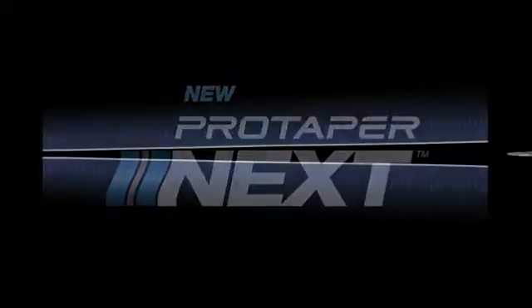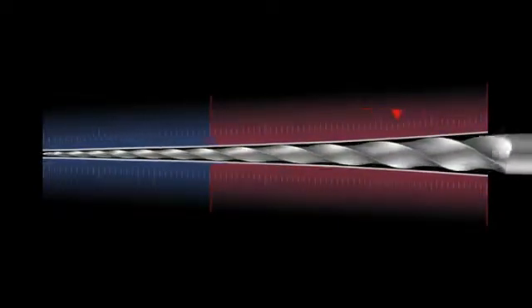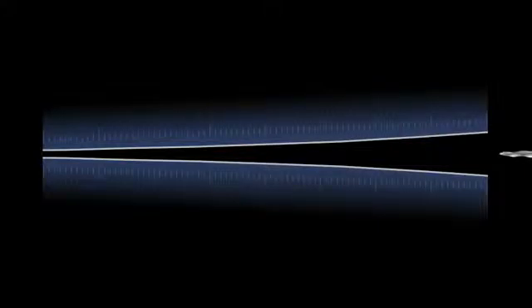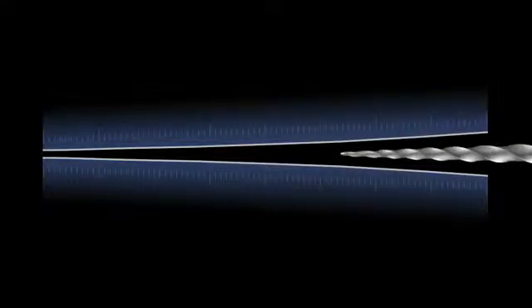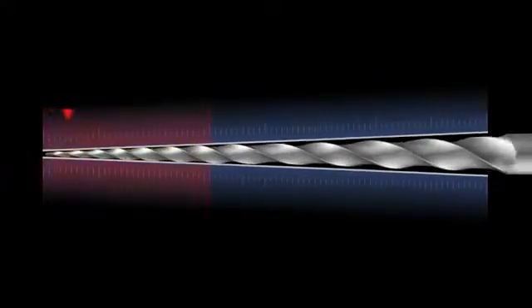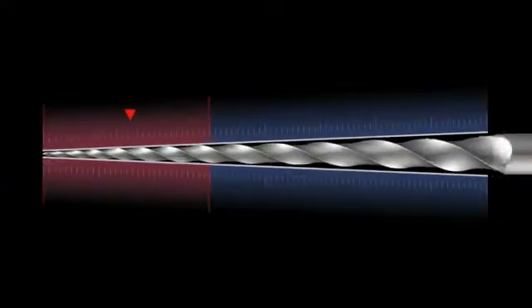ProTaper performance has been refined with ProTaper Next. The original variable tapered concept where the shapers cut dominantly in the coronal two-thirds and the finishers prepare the apical one-third has been enhanced.